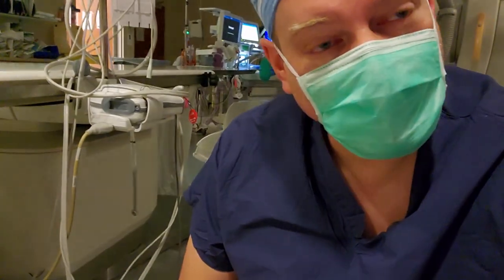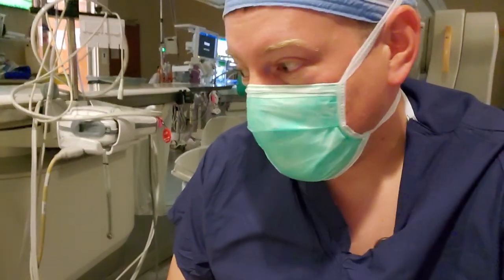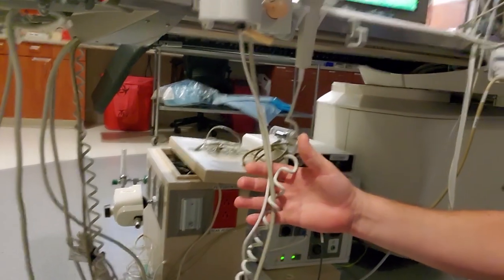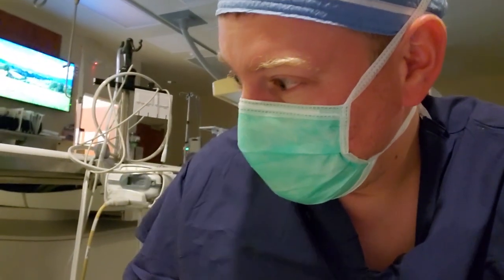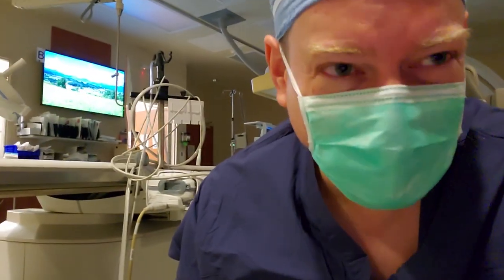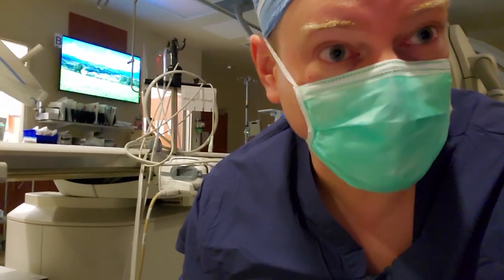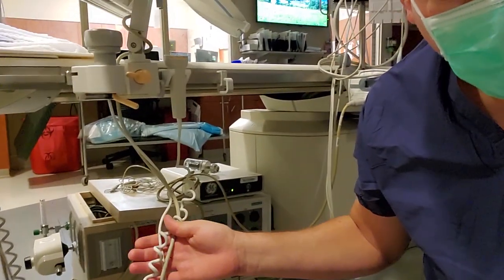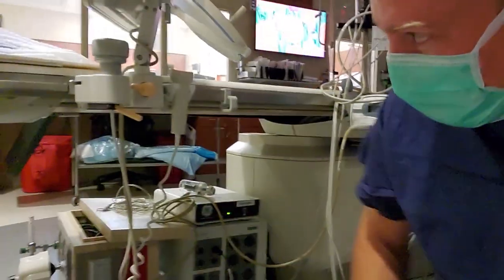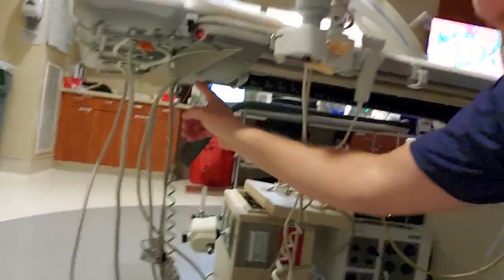Step two, we've got to try and minimize cable yank. And one of the ways that you can minimize cable yank is you make sure that your cables are not twisted together. These ones here are part of a real preventive maintenance, not the inventory maintenance, but a real preventive maintenance that we do during rounds. We try and untangle cables that are just messed up and all around each other, and it continues all the way down.